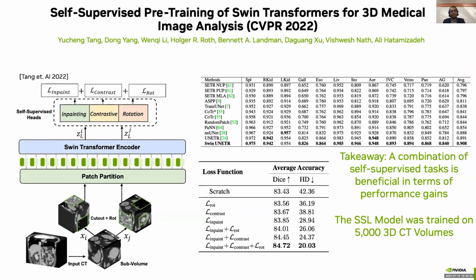So with self-supervised learning, we experimented quite a lot because it's very interesting. For example, I initially showed the augmentation. Now that's just one thing. I was earlier mentioning that you can give a lot of perspective with self-supervised learning because you've got many different kinds of tasks. And so our key takeaway from this work was that if you use many different pretext tasks, the model gets better. That's what we found and published. This is also, again, out there and available for use.